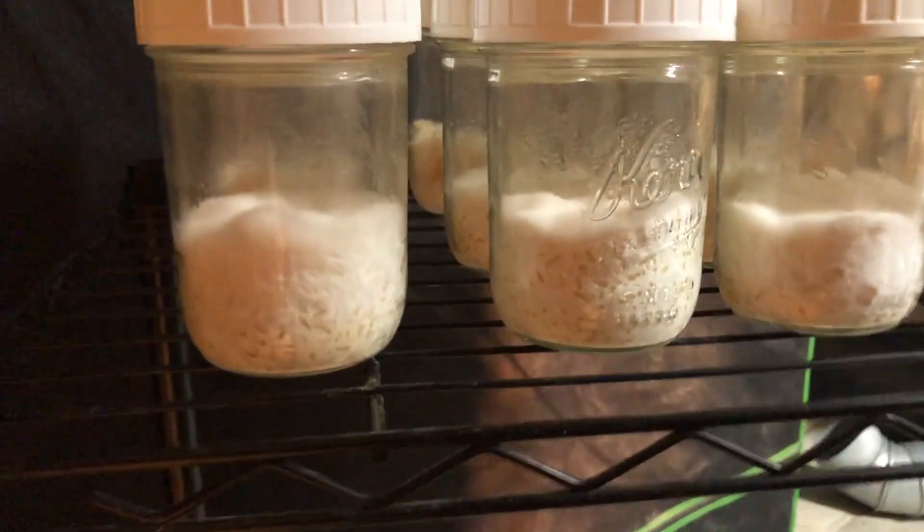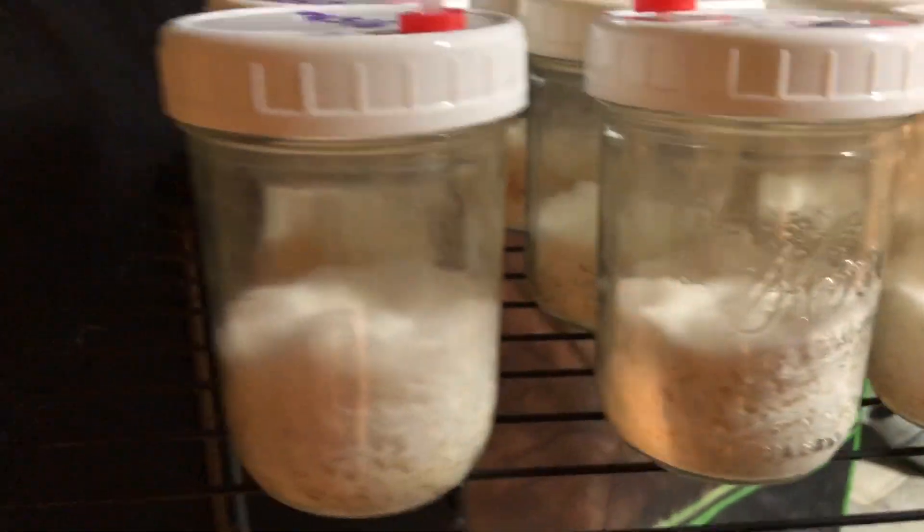Here's the first round of cordyceps going into my fruiting chamber. You can see there's a bunch of lion's mane and we've got some nicely colonized jars.